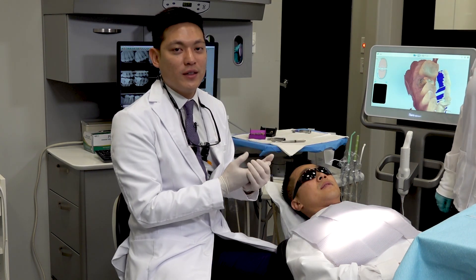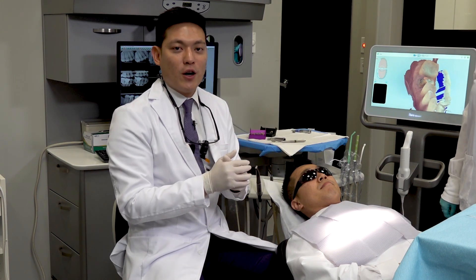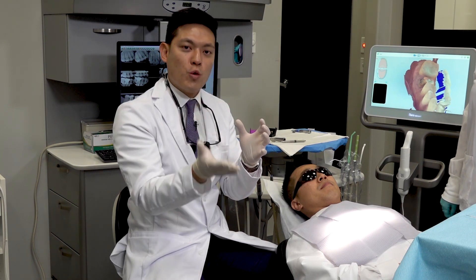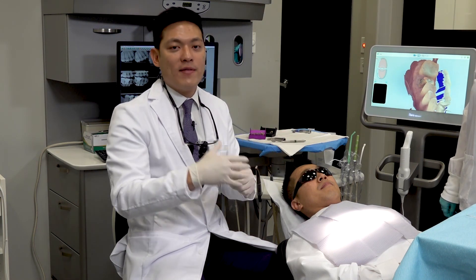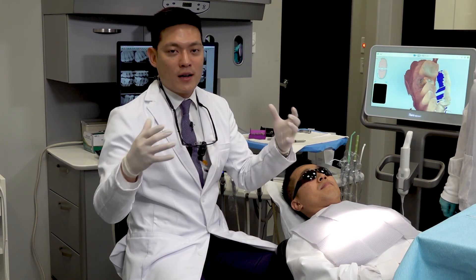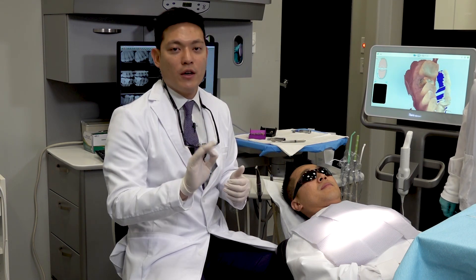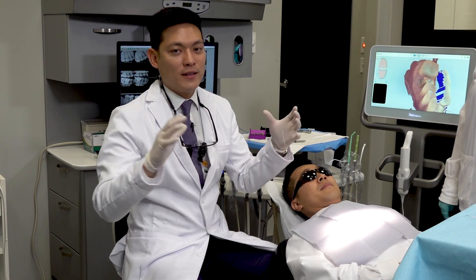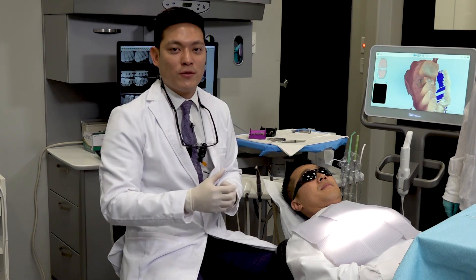Now when we go to digitally design the restoration, we have a solid surface to design to — we know precisely where the mesial of that neighboring tooth is to establish the correct contact value. In some cases it can be very challenging to capture under the undercut on adjacent teeth, especially a mesially tipped distal neighbor. We're mostly concerned with the height of contour — the widest portion where the design will contact. If you can accurately capture the upper half of the neighboring teeth, that's usually adequate to establish a contact surface in the design. You don't have to keep struggling — as long as you get most of the upper half of that contact surface, you'll be good to go.